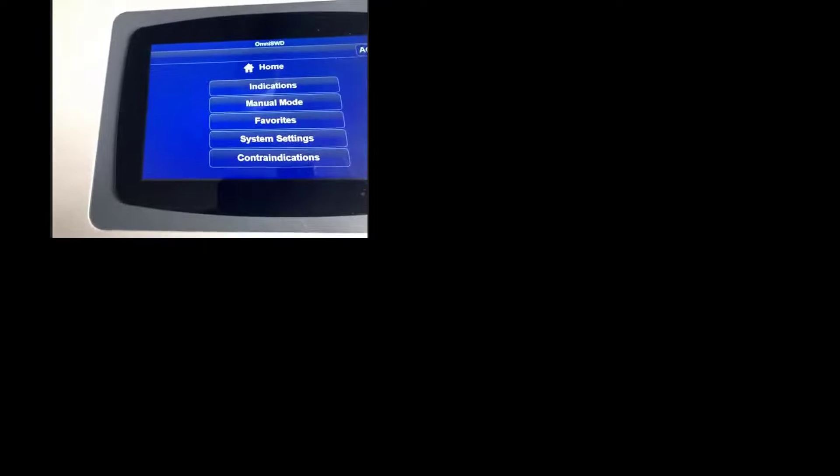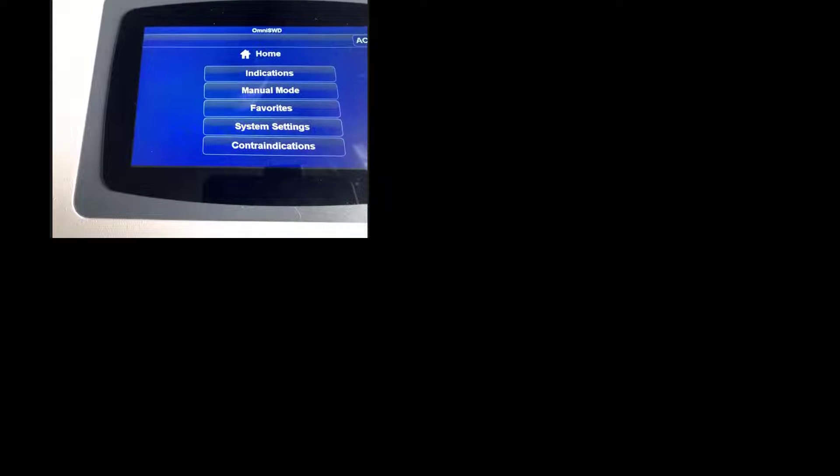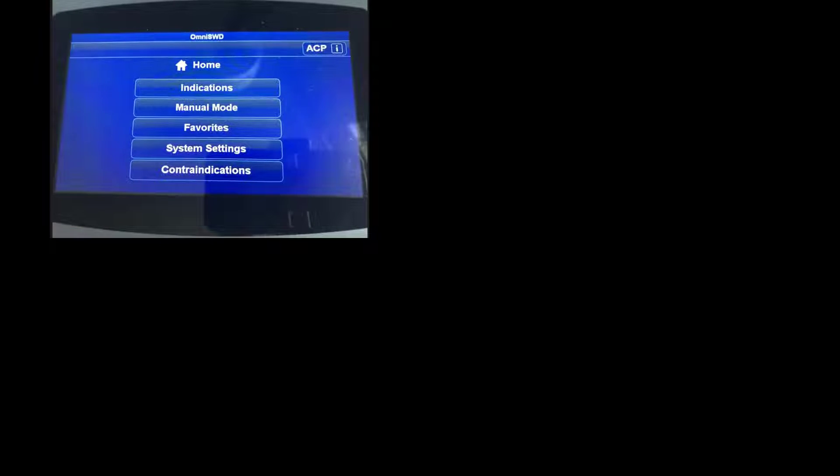Moving to the buttonology of this device: there is no battery option on the SWD. Push the power button and you'll see the screen. After the machine turns on, it goes through self-calibration to check for problems. If there's a problem, an error message will appear, and you can either call your consultant or call the 800 number on the sticker on the back of the unit. This is the home screen.